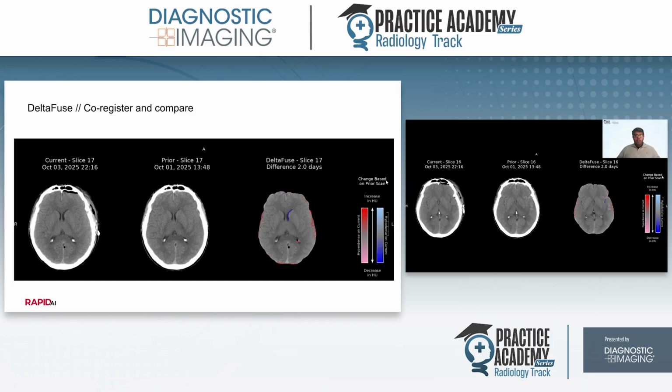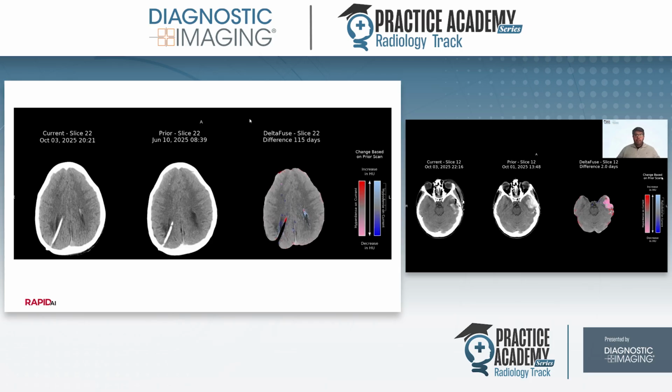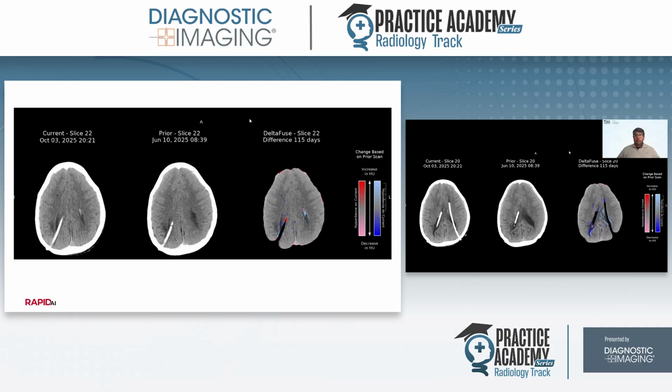And this is also helpful for when you're trying to assess ventricles. This honestly tends to be the part where I spend most of my time when I'm reading my inpatient follow-up exams, whether or not the ventricles are similar in size or not. Often, again, these patients have their head positioned very differently from scan to scan. So having a tool that lines it up well makes comparison much more accurate.